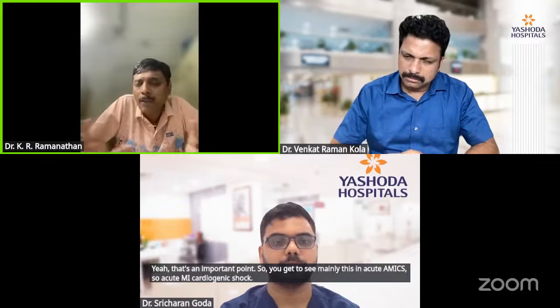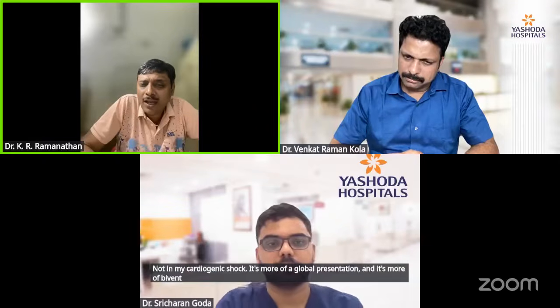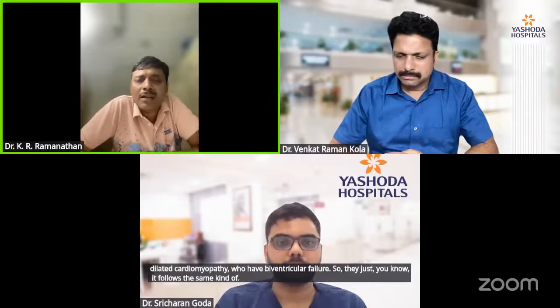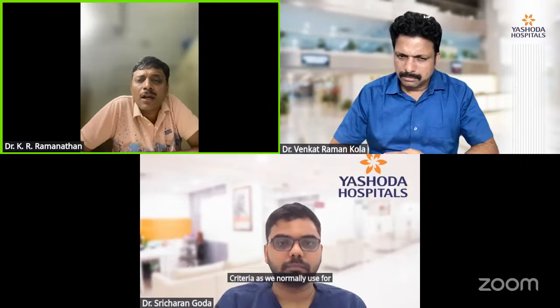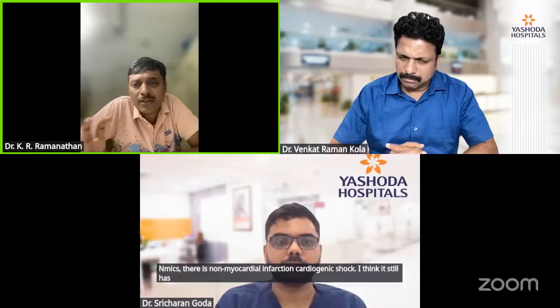So you get to see mainly this in AMICS, so acute MI cardiogenic shock. In non-MI cardiogenic shock, it's more of a global presentation. It's more of biventricular failure, and I feel ECMO definitely would have a role there. In fact, our last four ECMOs have been for patients with dilated cardiomyopathy who have biventricular failure. So it follows the same kind of criteria as we normally use for VA ECMO. So the role of VA ECMO in NMICS, that is non-myocardial infarction cardiogenic shock, I think it still has a role because of its presentation, especially with biventricular failure.